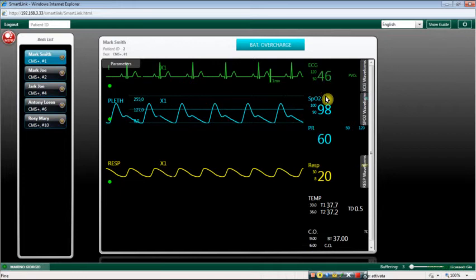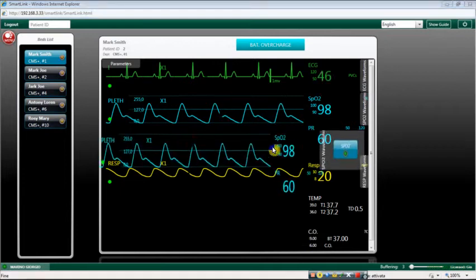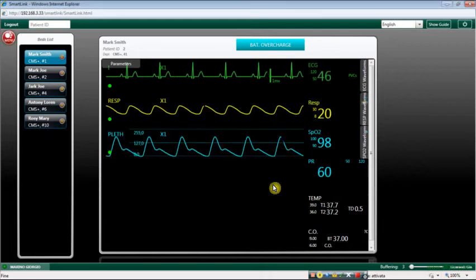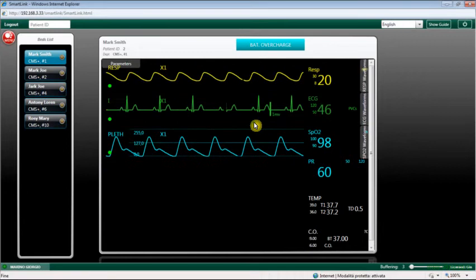Dragging with the mouse, you can move a parameter and its waveforms up and down on the screen to change the order of the displayed items.